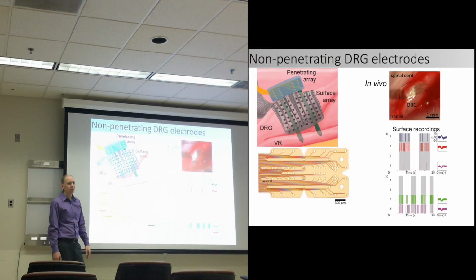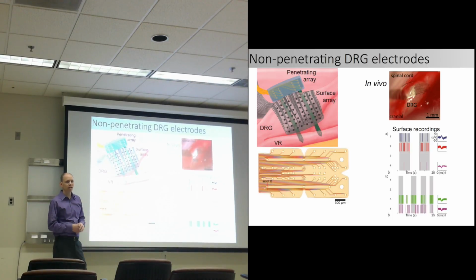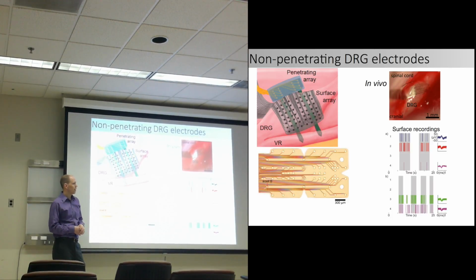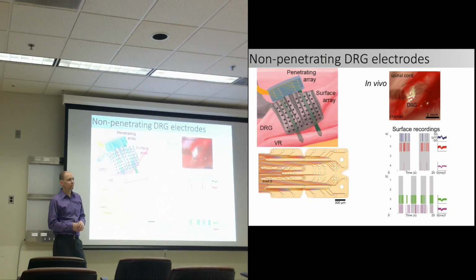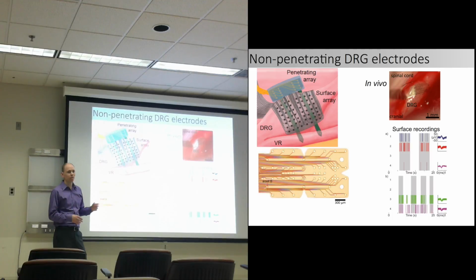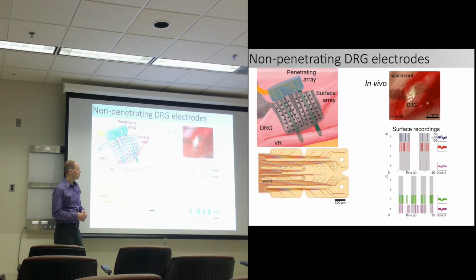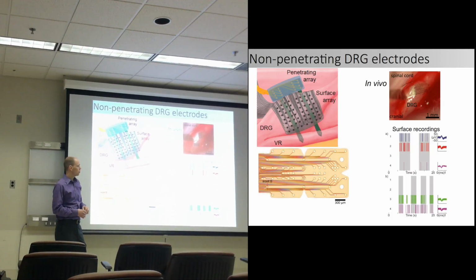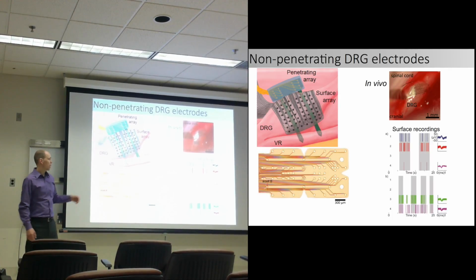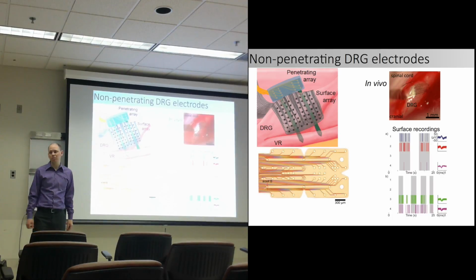Another picture: we did a few intraoperative studies with a neurosurgeon who did spine treatment, during breaks in the spine surgery with some of our electrodes on. They were ECoG, electrocorticography types of electrodes. They were not designed for this at all. It was just something we could get FDA approval for through the IRB. And we didn't see anything close to this. That was in case we had a little bit of pressure in the body. So really excited about how this technology is moving forward. We have a little bit of a push toward bladder-based applications, but even other things like locomotion and other functions.